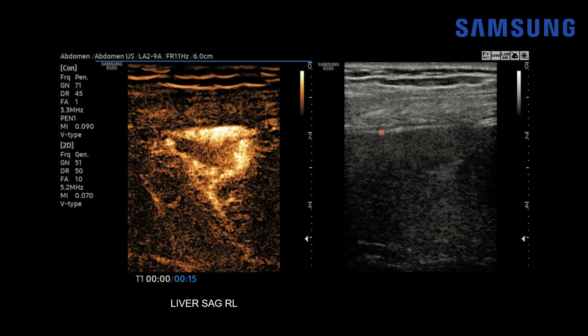You may wonder why the grayscale image is so grainy. That's because we're using a low mechanical index — here you can see MI 0.09, which is much lower than we typically use for routine diagnostic grayscale ultrasound.